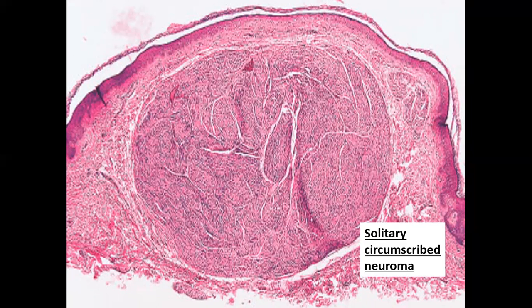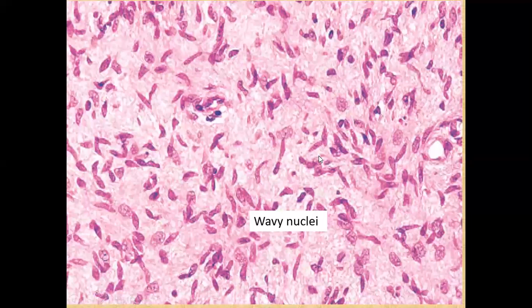This is a neuroma, which is originating from a nerve fiber, and the nerve fiber is characterized by having a rather loose stroma, and the nerve nuclei will be spindly but having wavy or comma shapes. So this is a neurofibroma where the tumor is rather loosely placed in comparison with DFSP, dermatofibroma, and leiomyoma. But the nuclei are either wavy or have a comma-shaped appearance.